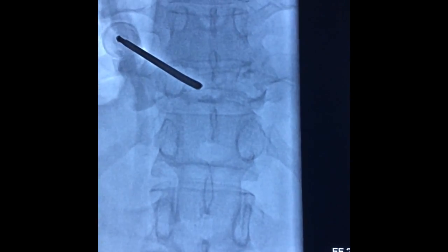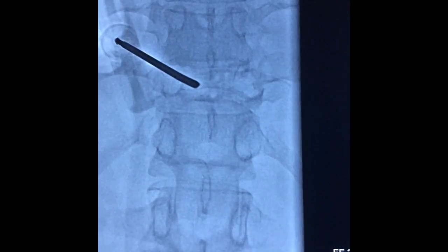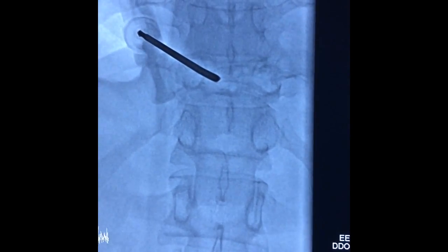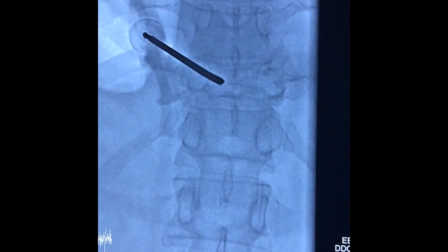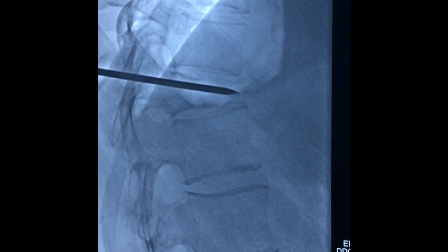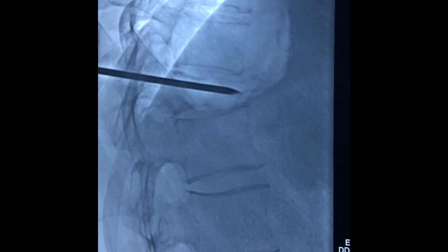During this procedure, we examine the spine from AP and lateral views. We place the needle into the middle of the vertebra and on the anterior border. That is what we have done here — the needle is placed absolutely at the anterior border.